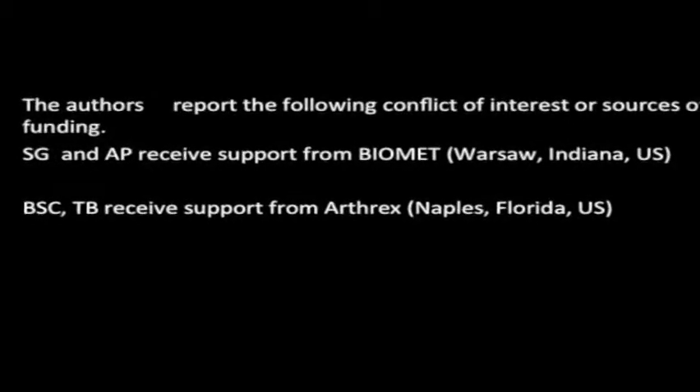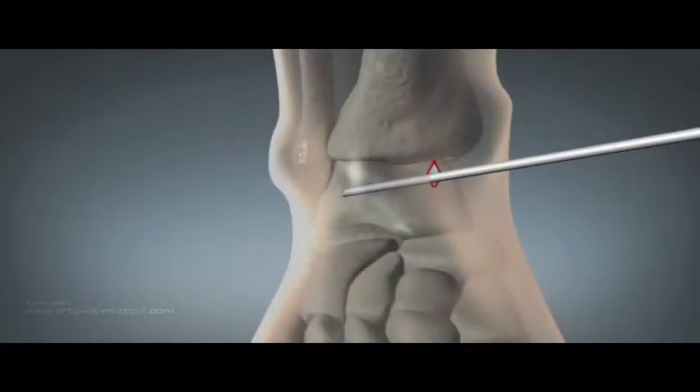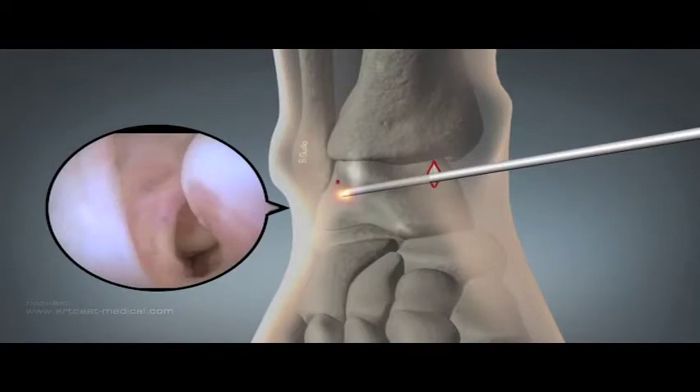Using routine anterior portals, the lateral space can be cleared of scar tissue in order to identify the ATFL remnant and its attachment to the fibula.